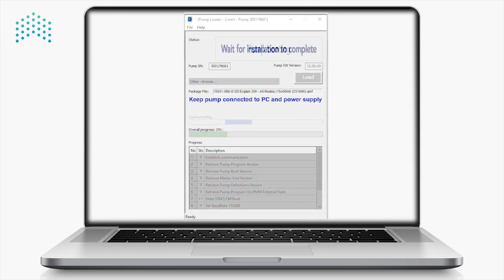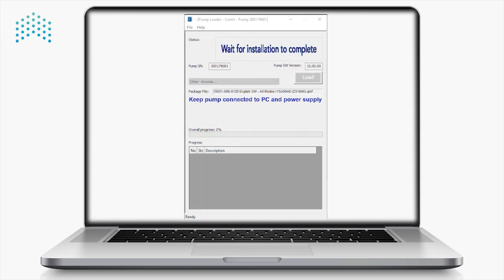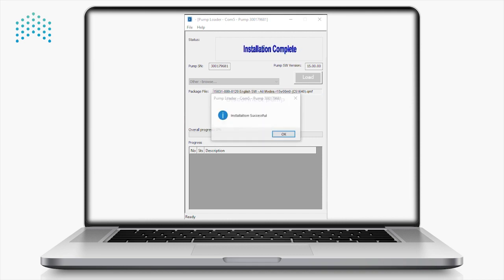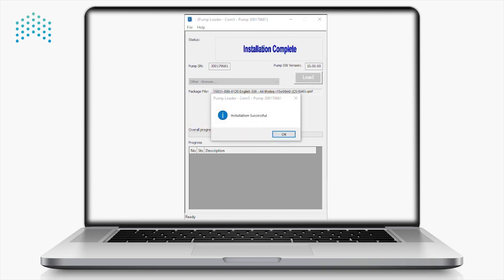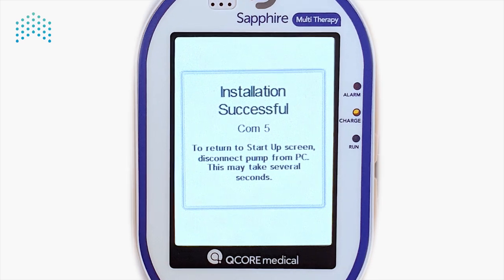The software update is completed when the message 'The update was completed successfully' appears on both the computer and the pump.